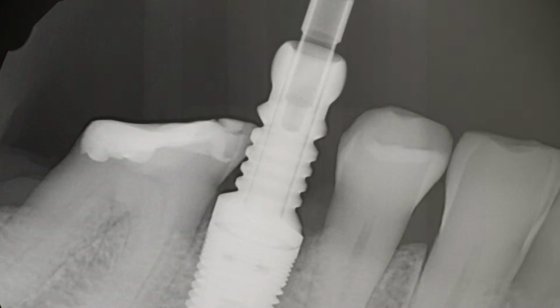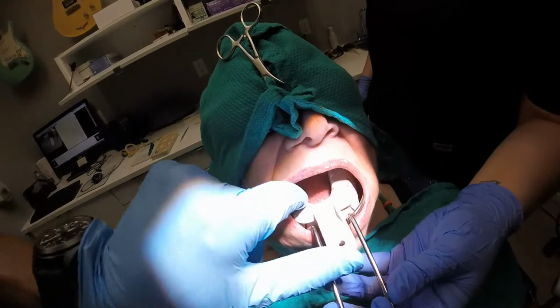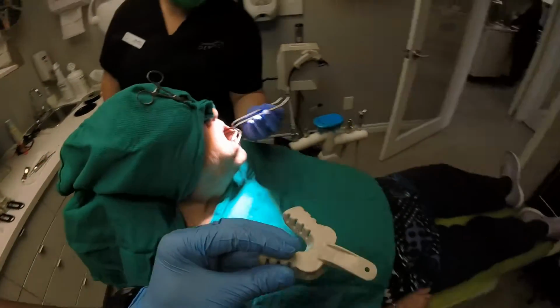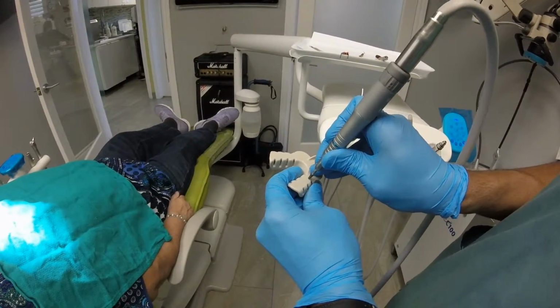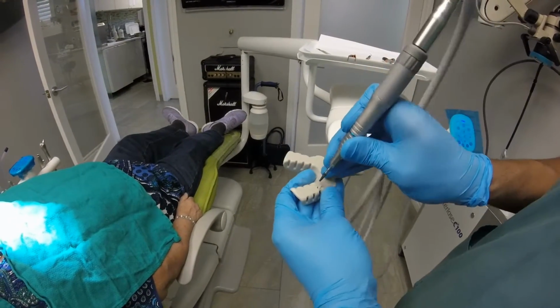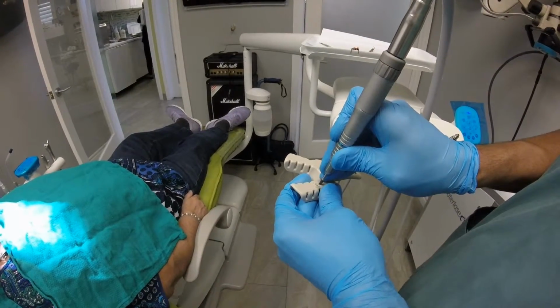So more or less, I like using these disposable trays. They're made by Teledyne Waterpik. You basically want to fit the impression tray in the mouth, and you want to mark with your finger where the opening is, that's why it's called an open tray. You've got to make an opening. The actual implant transfer coping is going to pop out of there. So you'll see me just cut this section out right here. I'm using a straight handpiece, just a standard acrylic burr.